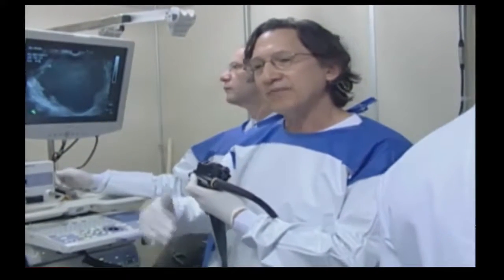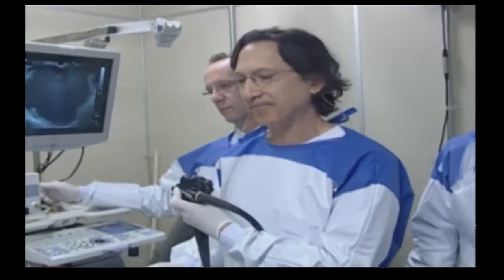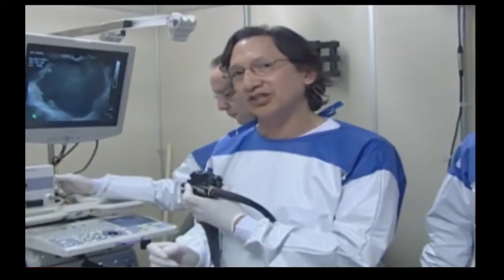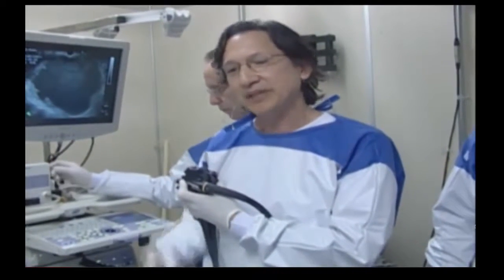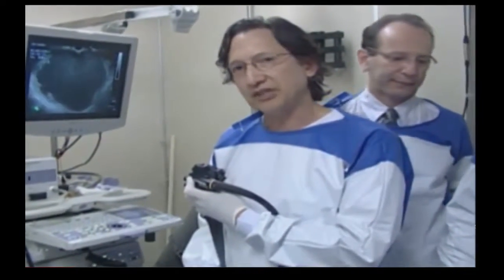cytology. That's always routine, because it's always possible that we may misinterpret this to be a pseudocyst when in fact it's a neoplastic cyst, a mucinous cystadenoma. Then afterwards we will inject contrast. Now we're not going to do that today because we have no X-ray, and the purpose of this demonstration is to show you how we can drain these cysts without X-ray at all. But the second step would normally be, in X-ray, to inject contrast and define the anatomy of the cyst.